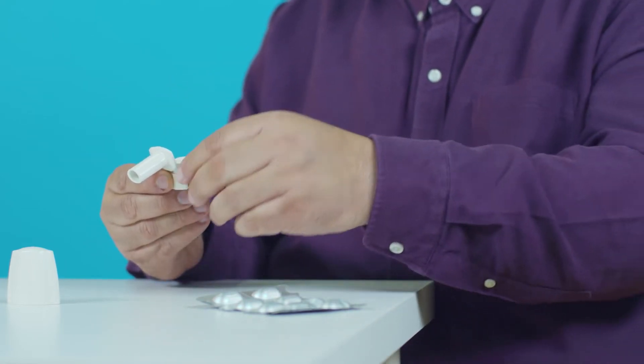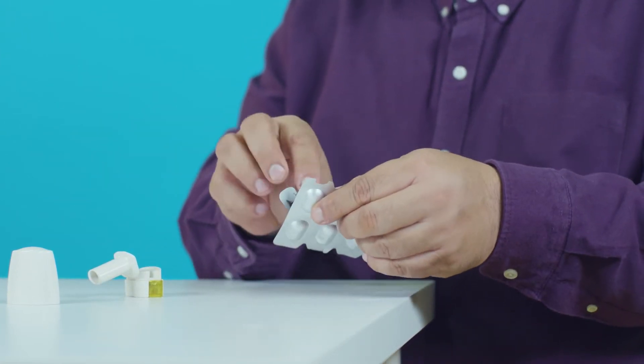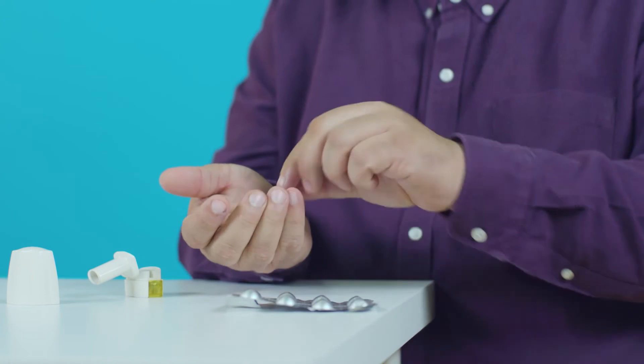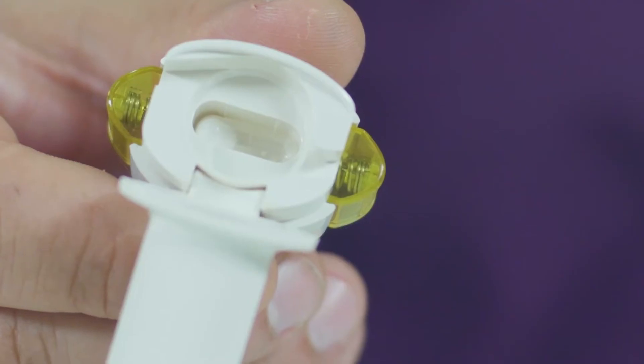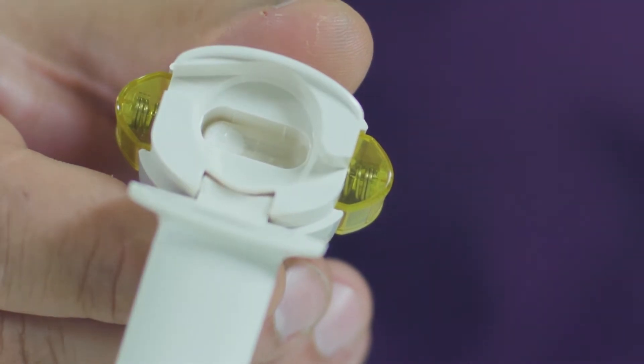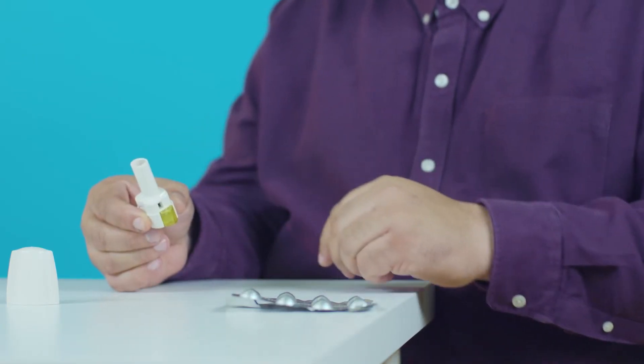Next, take a capsule from the blister pack. Only use a capsule if it's been sealed inside the foil blister pack. Put the capsule inside the inhaler. It's important to put the capsule into the inner chamber and not into the mouthpiece. Close the inhaler until you hear a click.